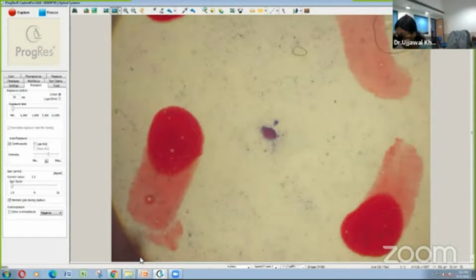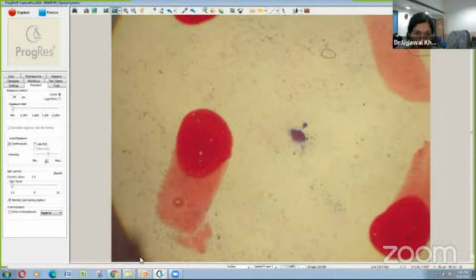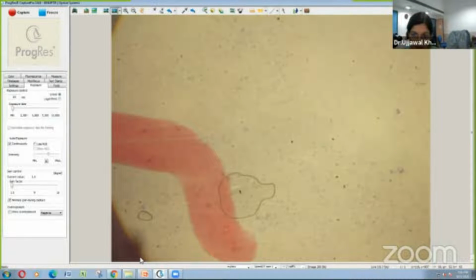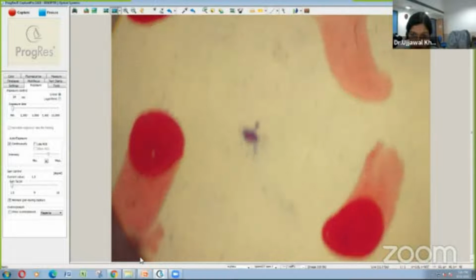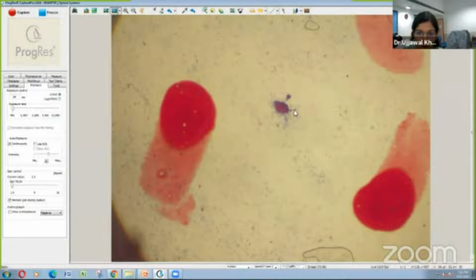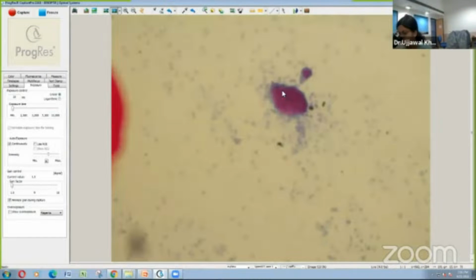So this is a Pap-stained bronchoalveolar lavage fluid for this case. This Pap-stained smear is showing eosinophilic foamy exudates, which are also known as alveolar casts. In the background we can see inflammatory cells, neutrophils, and macrophages, along with alveolar macrophages. What was very catchy in these smears was the presence of these foamy eosinophilic exudates.